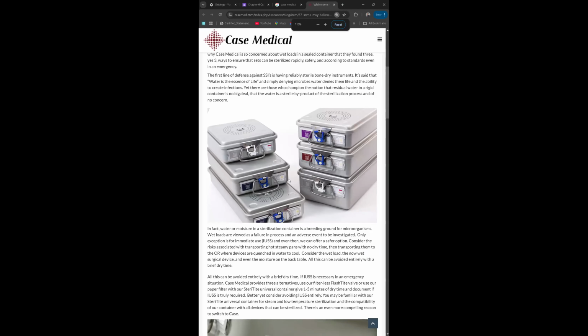Yes. So my brother who is asking the question, the basket goes inside this container. And then on the container, you see that there are holes, some circular holes at the top. These holes must be covered to reduce exposure to microorganisms. So we put a filter in there, and then the filter is held in place by the filter holder.